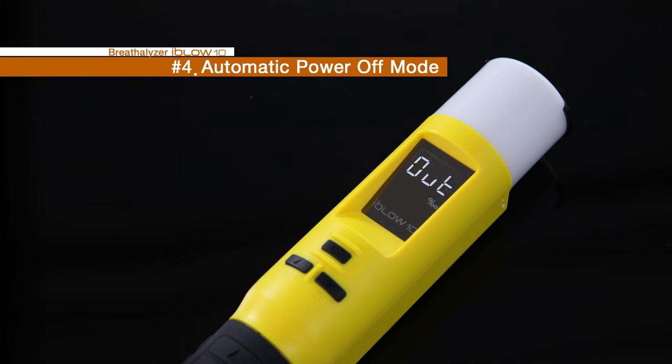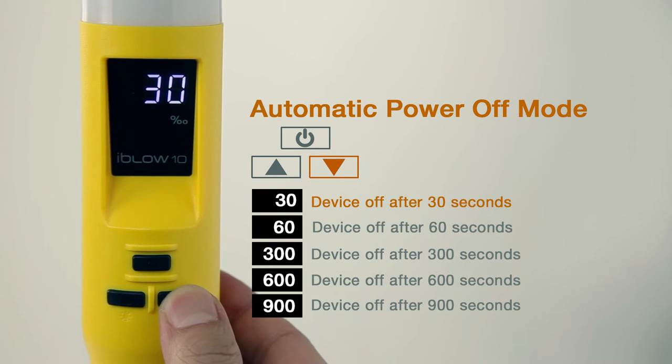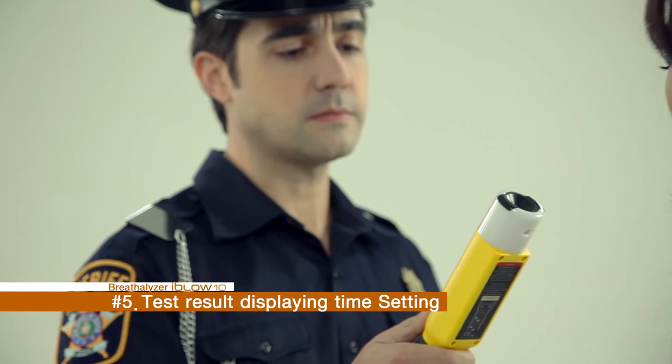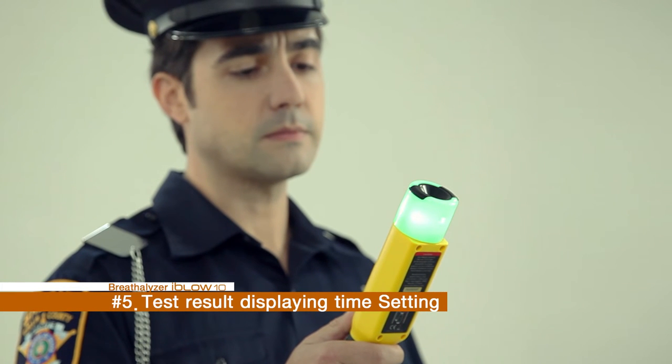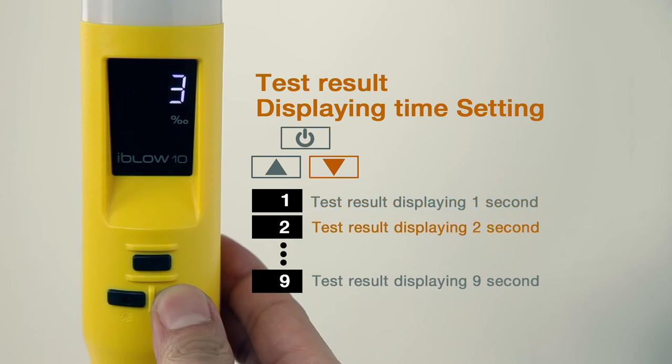4OF is an automatic power off mode. The timer can be adjusted to 30, 60, 300, 600, or 900 seconds. 5ST is a setting mode for the duration time of the test result that will be indicated on the display. The duration time can be adjusted one second at a time for up to 9 seconds.